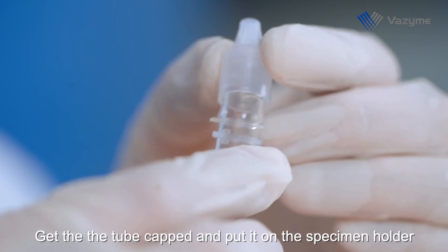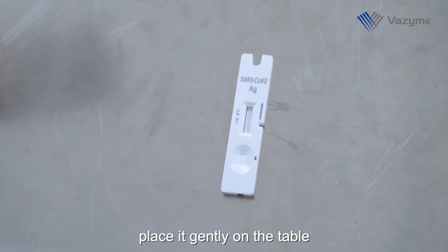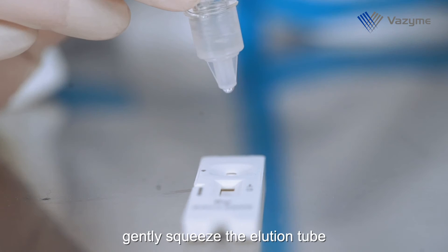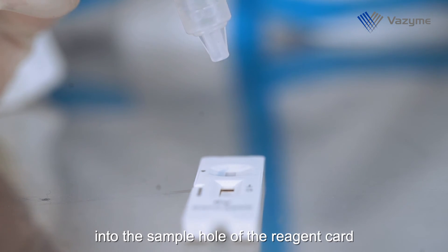Cap the tube and place it on the specimen holder. Unseal the cassette package, take the cassette, and place it gently on the table. Place the sample elution tube upside down above the sample hole of the reagent card and gently squeeze the elution tube to drop four drops — approximately 80 microliters — into the sample hole of the reagent card, then start timing.